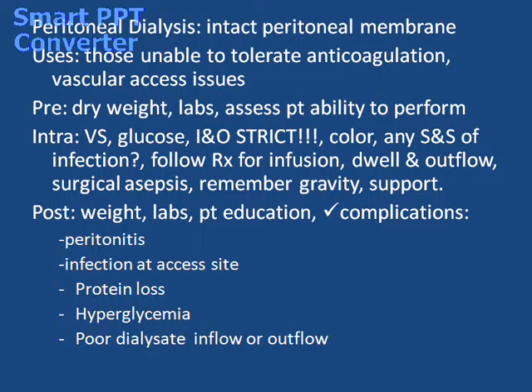We're going to be watching their glucose level. We're going to record the amount of inflow compared to the outflow of the dialysate. We're going to have a real close look at the color. We expect the dialysate to come out a clear light yellow, and the amount should be equal to or more than what we put in. So we want to pull from them.